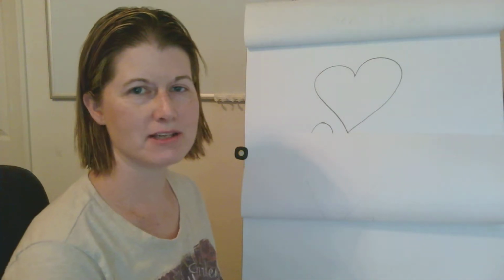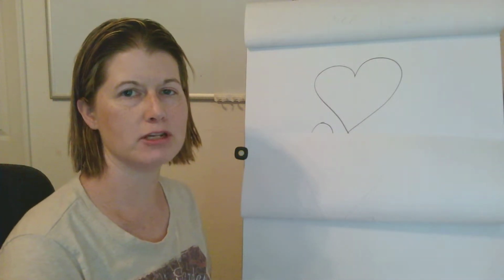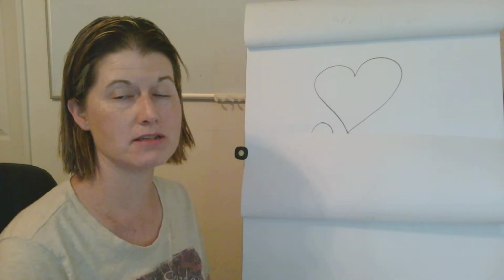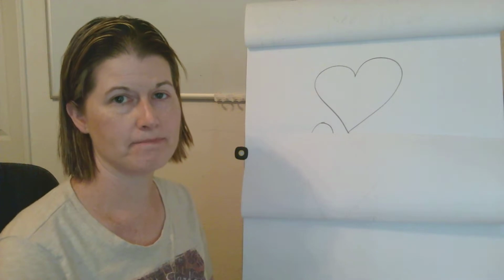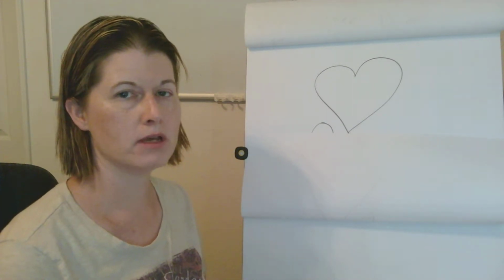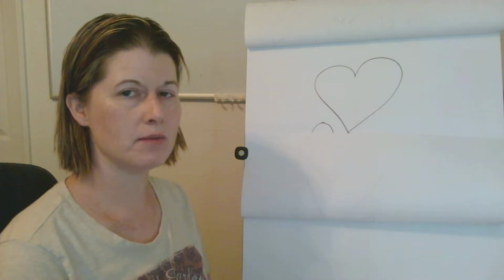Hi guys, so today I'm going to talk about the EKG, and I'm going to try to do little video snippets so that it's easier to digest. The videos are a little bit smaller. So first we're going to just talk about a general EKG concept.